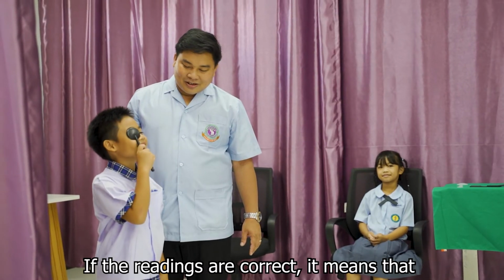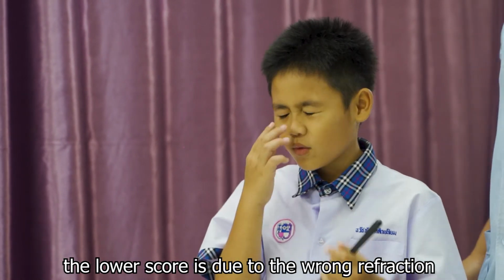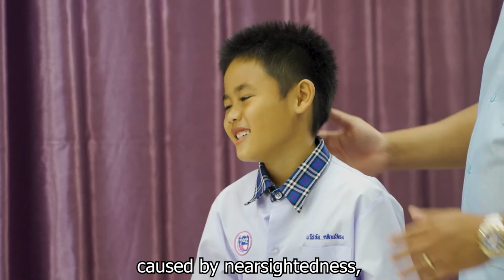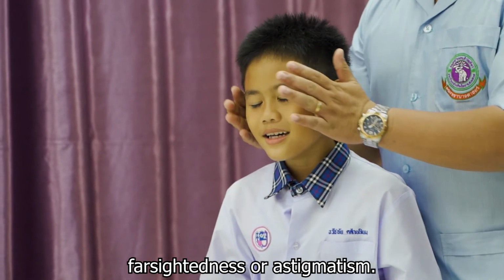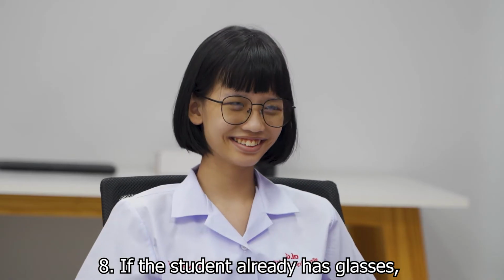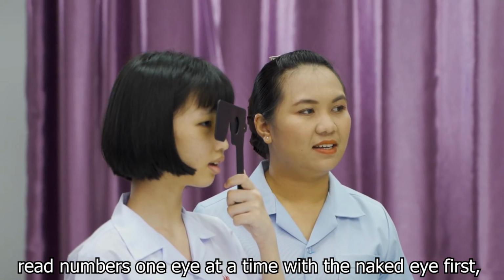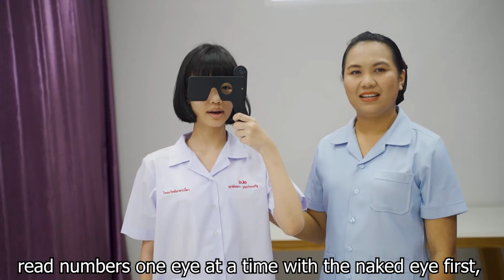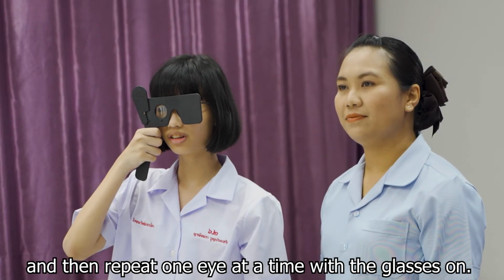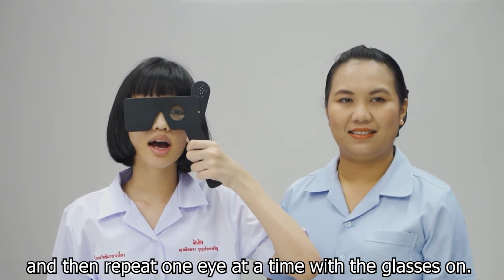If the readings are correct, it means that the lower score is due to a refractive error caused by nearsightedness, farsightedness, or astigmatism. 8. If the student already has glasses, read numbers one eye at a time without the glasses first, and then repeat one eye at a time with the glasses on.